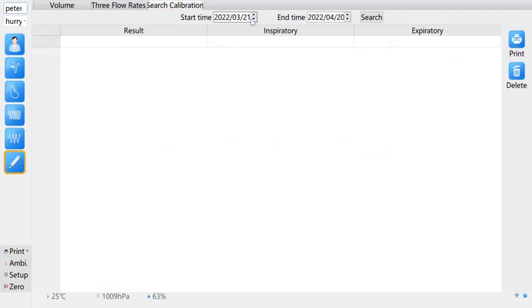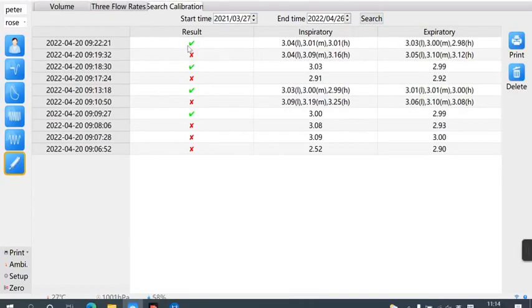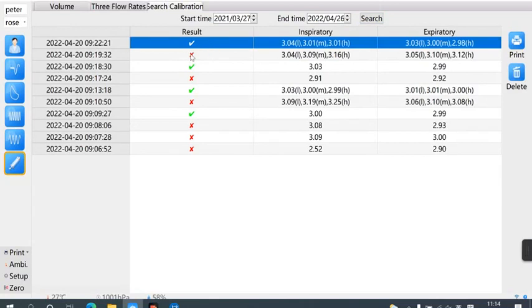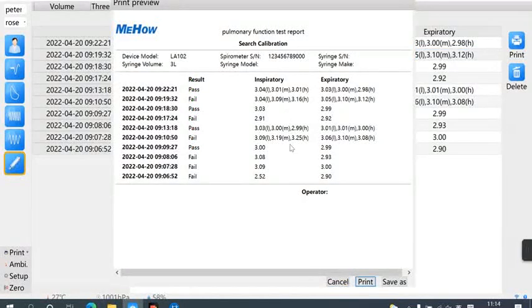Select the start time and end time to query, and click Query. The successful calibration is indicated by a green tick, and the failure is indicated by a red cross. Click Print on the right to print the calibration results of the selected date range.